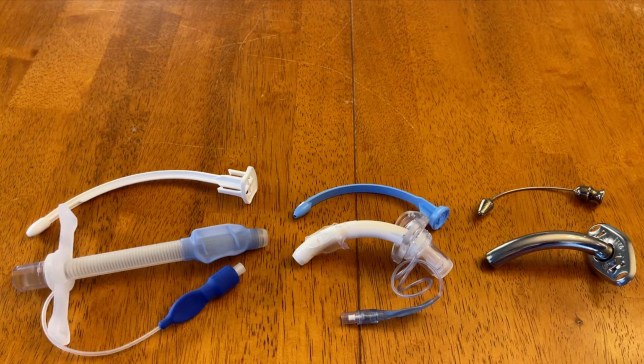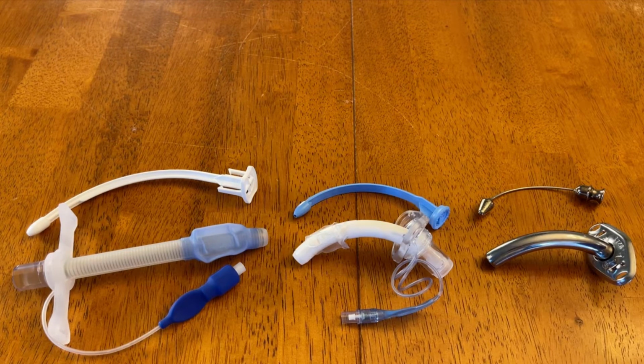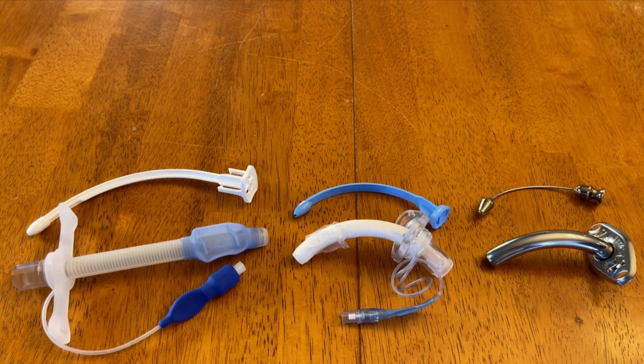Hey folks, Matt here with another video where today we're going to be talking about tracheostomy tubes with the real purpose of just providing an overview of some of the basic components of a tracheostomy tube. And as you can see before me, I have a few examples set out, and these are in no way all the different types of tracheostomies manufactured and available out on the market, but just a few examples that I have to review some of these basic components.